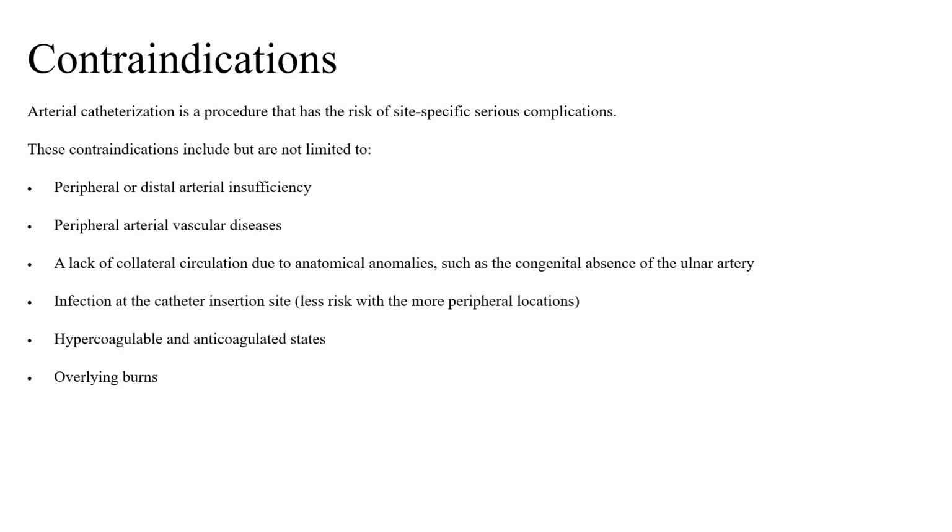If your patient is anticoagulated or in a hypercoagulable state, we know that the arterial line has an increased risk of clots in and of itself. So if they're already hypercoagulable, that's adding insult to injury, so we don't want to do that. But certainly if patients are anticoagulated, this is a pretty invasive procedure, and so the inherent risks of bleeding, hematoma, bruising, and stuff are going to be higher. So you have to, again, weigh your benefits and risks.